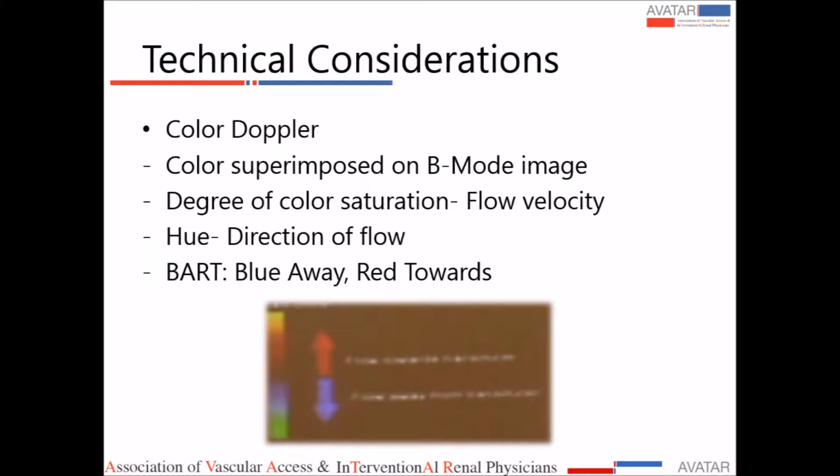And the hue is the direction of the flow, and it's an easy mnemonic, BART. When you look at it, blue does not mean venous, red does not mean arterial. Blue means away from the probe, and red means towards the probe.